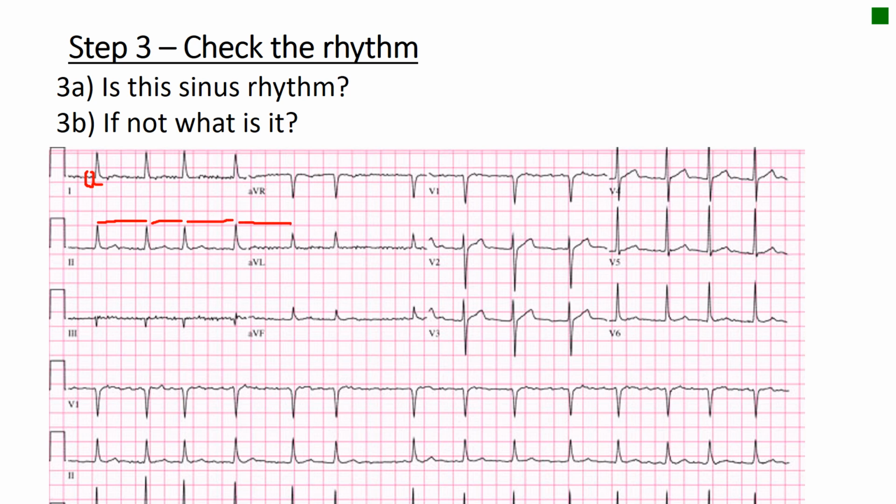So here, you see it's very irregular, the distance between the RR waves along the ECG. Can we properly see a P wave? We can't really. It's all a wiggly line. It's not really straight, and then a P wave. It's kind of fluttering on the baseline there. There's not any obvious P wave. The QRS complexes are irregularly spaced apart. This patient is not in normal sinus rhythm. In fact, they're in what we call atrial fibrillation.